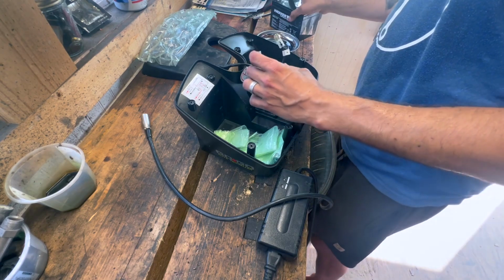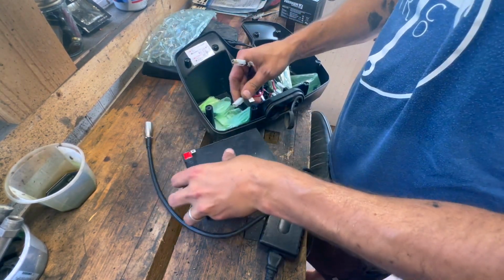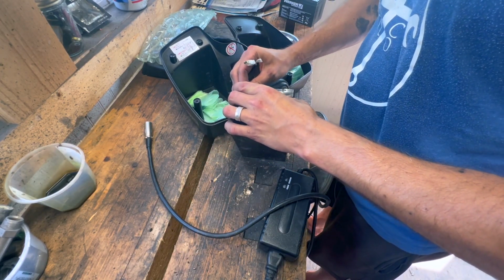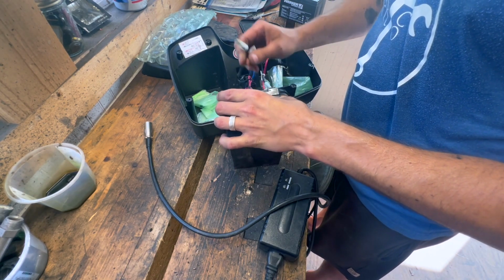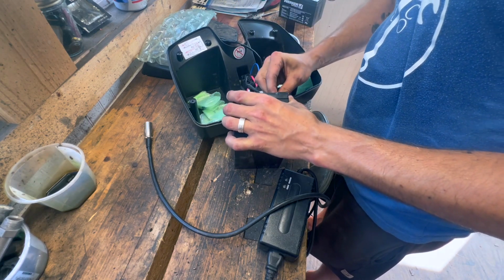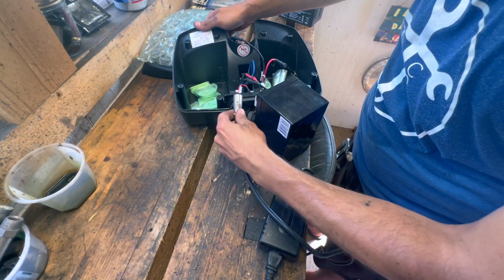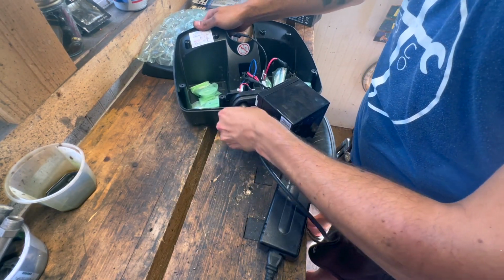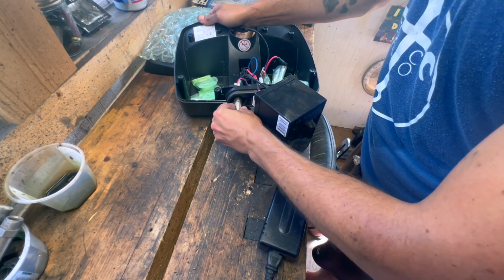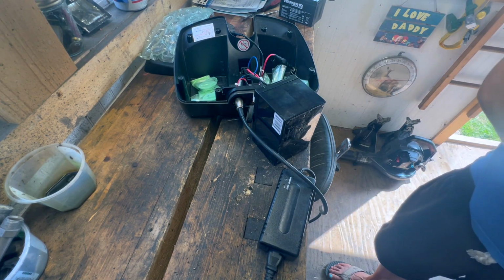I want to see if I can just charge one of these individually. If it'll reach. Of course, that's the cruddy one. And then I just want to see, because maybe I tried flipping that switch that was in the front and I got nothing, so I'm not sure what that would even do.